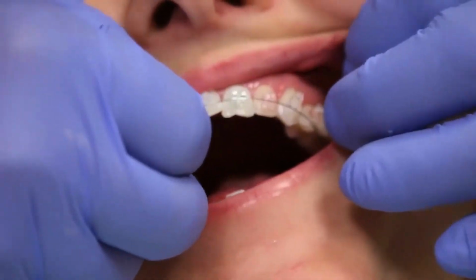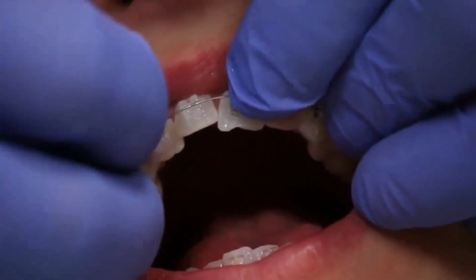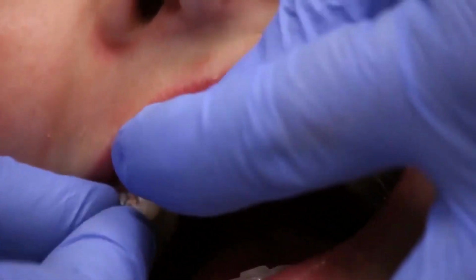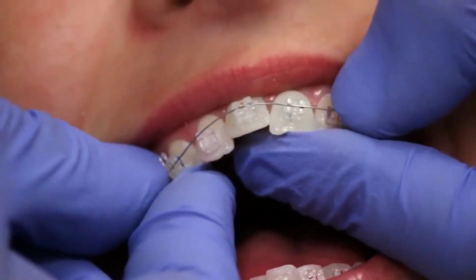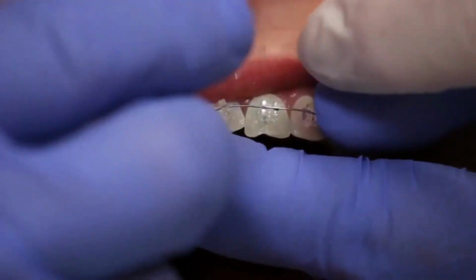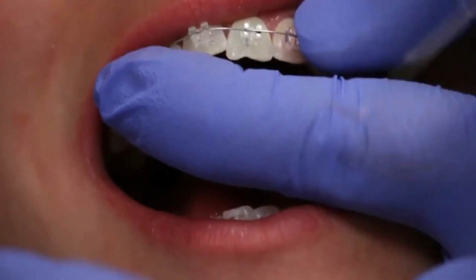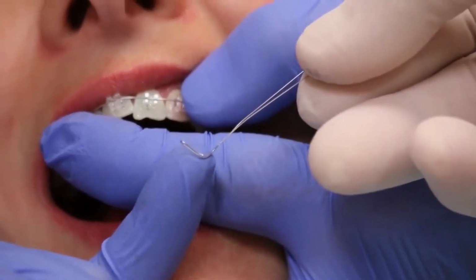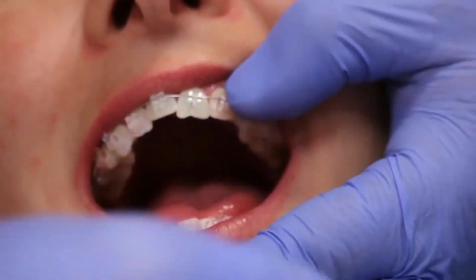Now we just seat the wire back and make sure that our bends are correct. You want to have, no, let me show you. You want to have your assistant, can you see this? Pass you the ligature with a little bend. So when the ligature is passed to you, can you grab it right here?